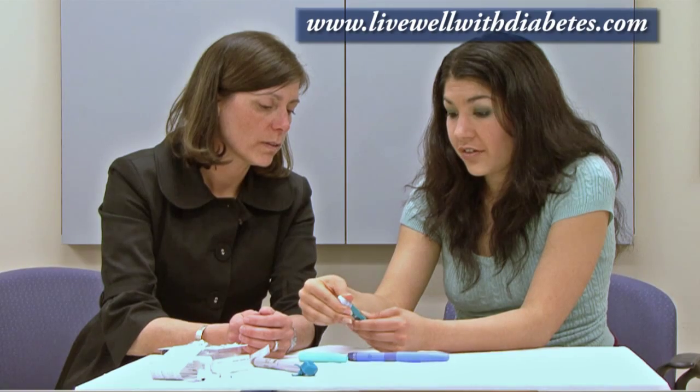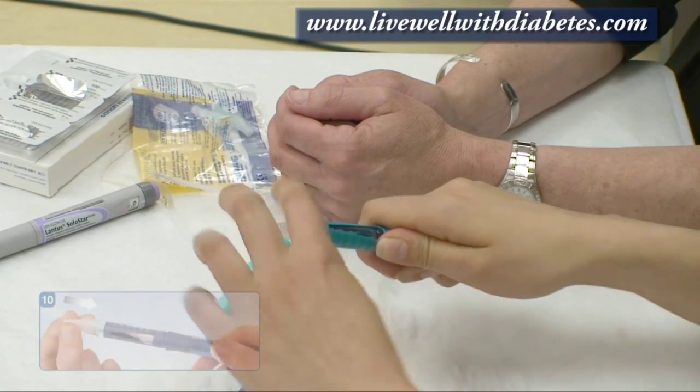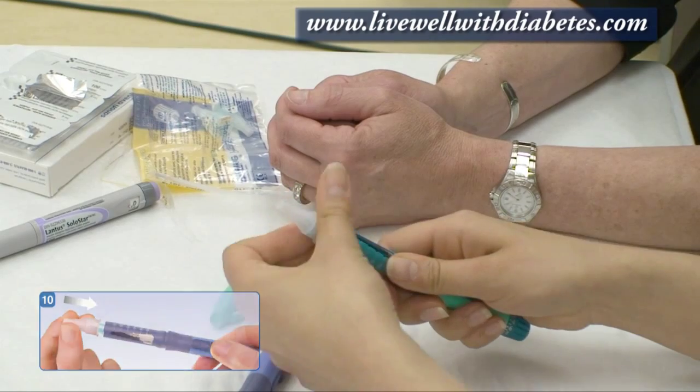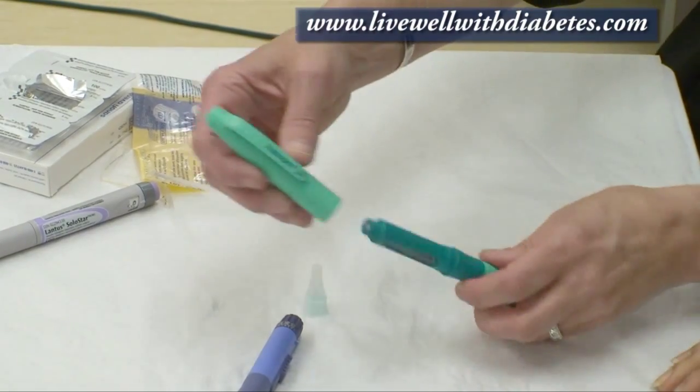After I'm finished, the needle is only good for one time use. I unscrew the tip just like that and dispose of it. Perfect — let's put the cap back on top.